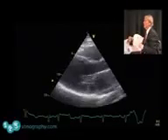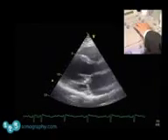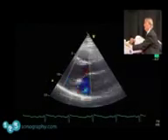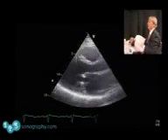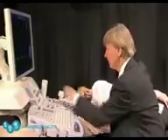This is actually also appreciated when you look at the parasternal long axis view. You see that there's doming, but the valve does open quite nicely. But coming back to this view, I also want to show you the color, simply because we want to see if there's turbulent inflow into the valve. Not really. There's some degree of regurgitation. We'll come to that later. But certainly the patient does not have much turbulent inflow, which fits very nicely to a rheumatic stenosis, which is not severe. But to get more quantitative information, we have to look at the apical views.